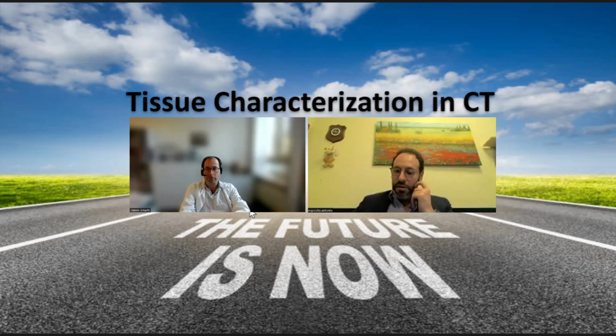Yes, really perimyocarditis, and also a lot of unexpected diagnoses. We now have more than 300 patients studied with this approach in the emergency department, and you find everything. Patients with amyloidosis, without a history of amyloidosis, that have the first clinical sign with an arrhythmia, with a syncope or with chest pain, they arrive in the emergency department. Patients with an unexpected hypertrophic cardiomyopathy, 2 patients with cardiac metastasis, everything. Essentially, you switch on the light on something that otherwise requires a lot of clinical observation, additional examinations, and so on.